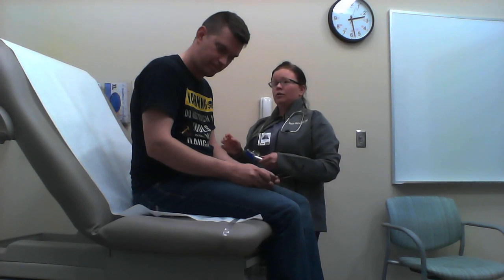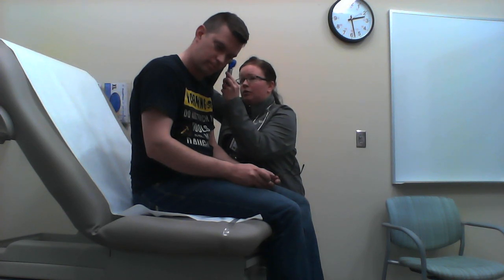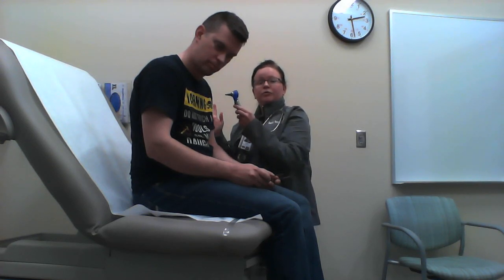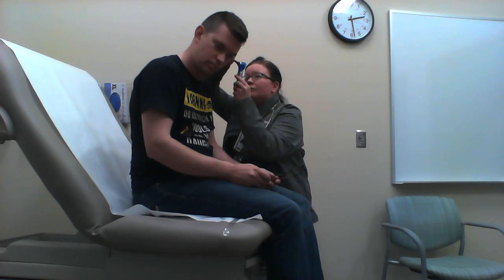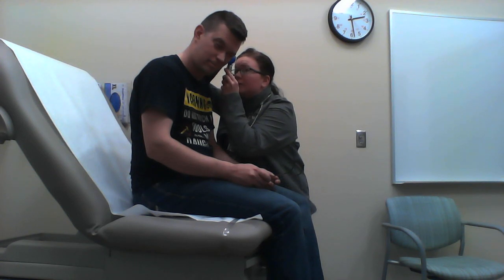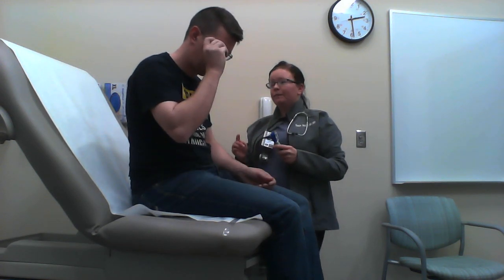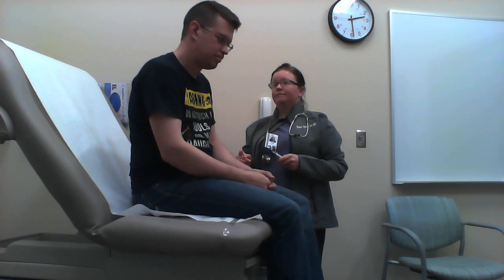All right. We're going to look in the outer part of the ear canal, and there's a little bit of cerumen, which is normal. You know that amount, color, consistency. Moving on to the middle ear and inner ear. Look at the tympanic membrane. Okay. Look. Nice and pearly gray. Good cone of light. Now this looks fine. So that is a normal finding.